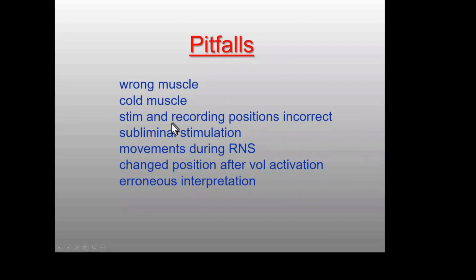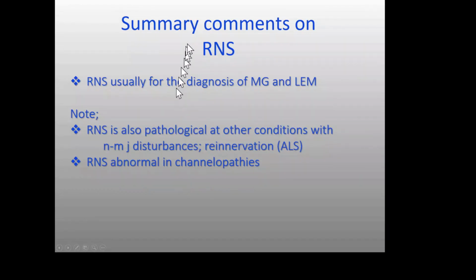It looks simple, but it can give quite a lot of information, but it has to be technically perfect. To summarize, it is quite a good technique for diagnosis of myasthenia, not for excluding myasthenia, but for confirming. It is available in all EMG laboratories, I suppose. But a decrement is not equal to myasthenia or equal to Lambert Eaton myasthenia.